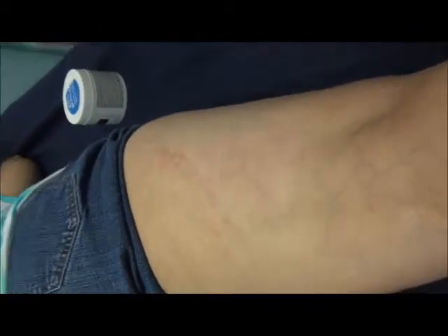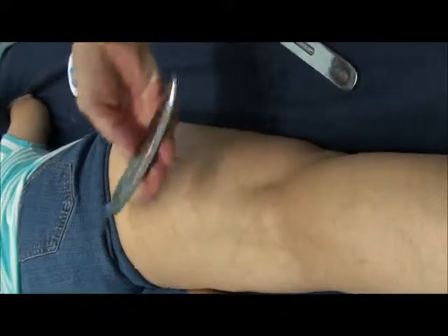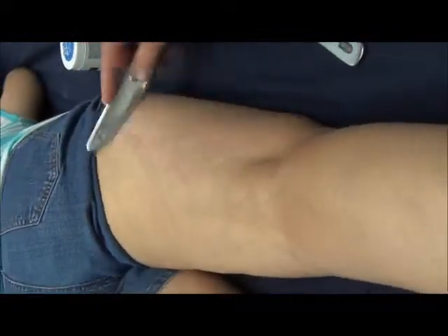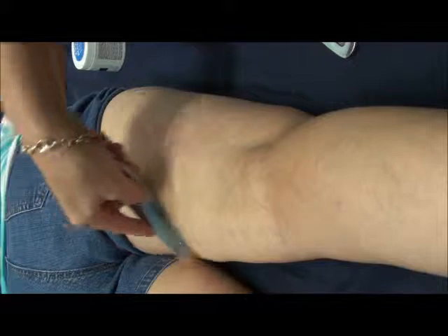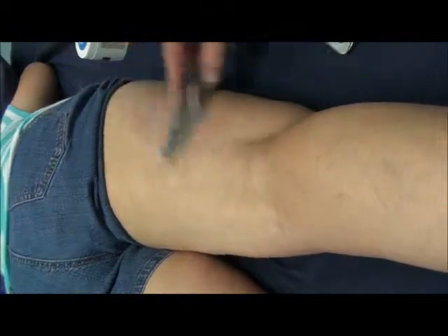After I use that instrument, I see where I've brought up some hyperemia, and I take this instrument and I begin scraping it. And you can see she is flinching. She's flinching because this muscle tends to be tender to treat. And she really has a piece of scar right in there. Do you remember any injury to your muscle here? No.